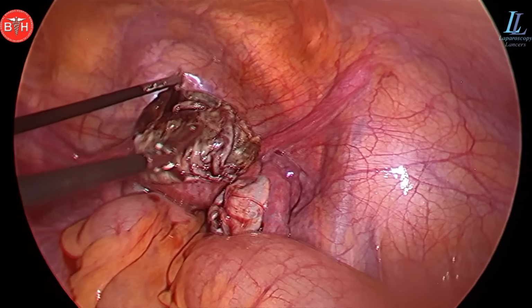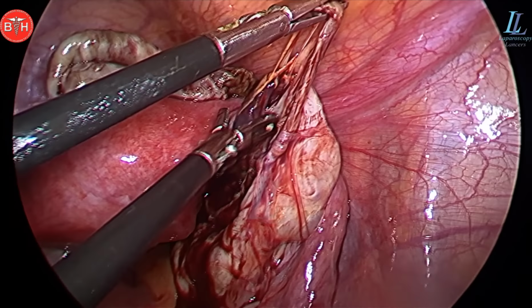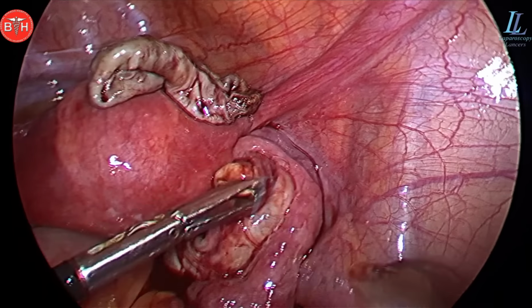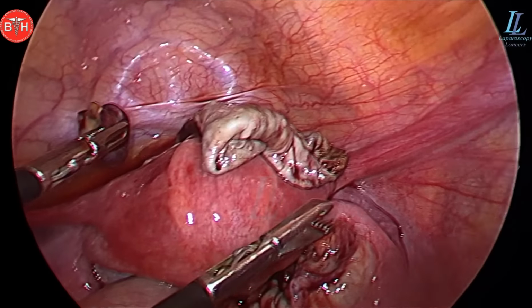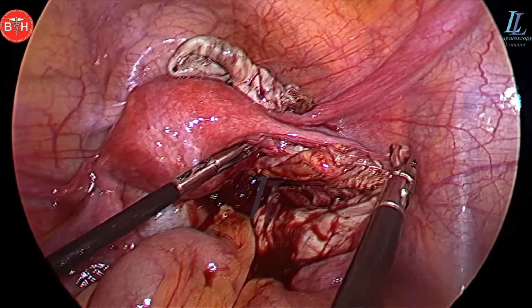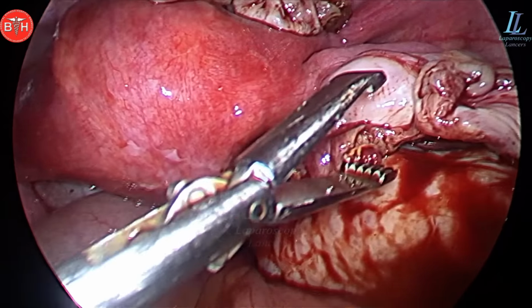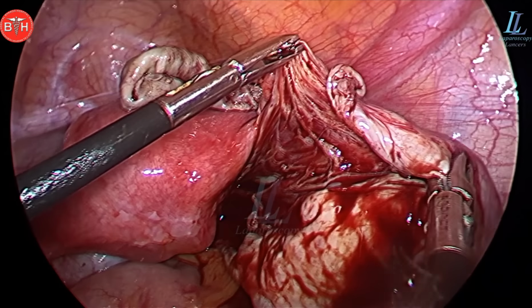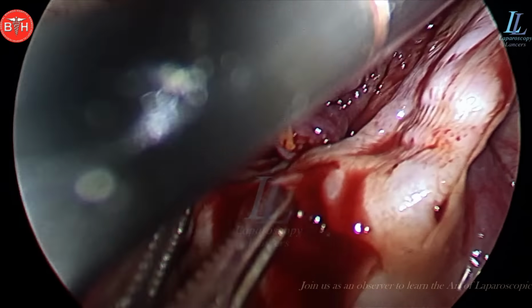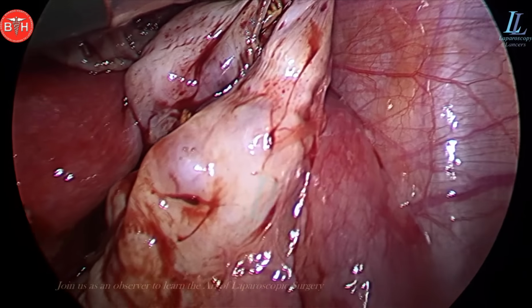There you can see the complete cyst has been excised, nice and beautifully excised, and there's the stretched out ovarian tissue and a bit of tissues left that has to be hand picked nicely. You can see almost a complete excision of the cyst, and we'll search for if any cyst is there maybe, so we have to remove that also. A thorough search is required, and there you can see in the first look it feels that everything is okay, but you should always suspect something more cyst in a case of endometriosis.